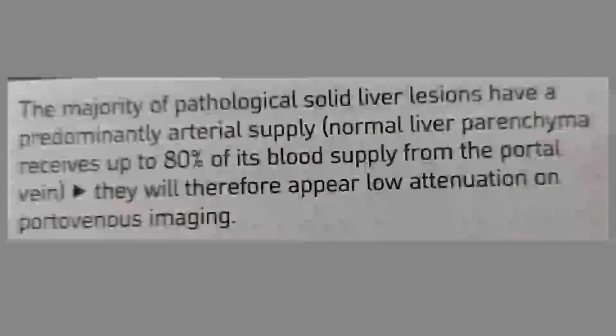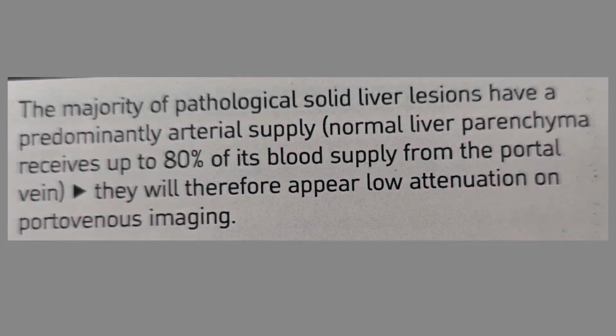So the liver attenuation, the liver CT density, would be 54 to 60 Hounsfield units. This is when you need non-contrast CT, which is used for fatty deposition or iron deposition. In case of any diffuse abnormalities, you need non-contrast CT. And if you suspect any calcification or any blood, then again you don't need contrast; simply a non-contrast CT would be valuable.